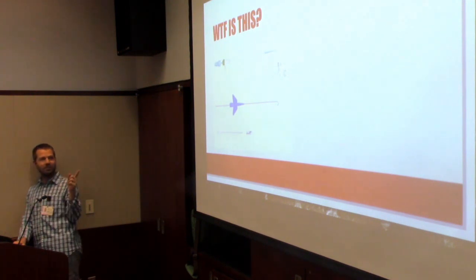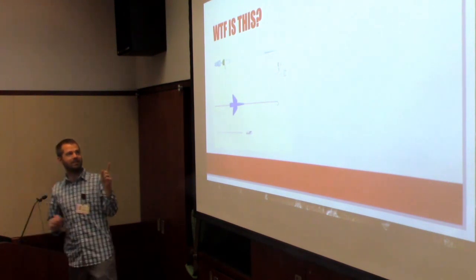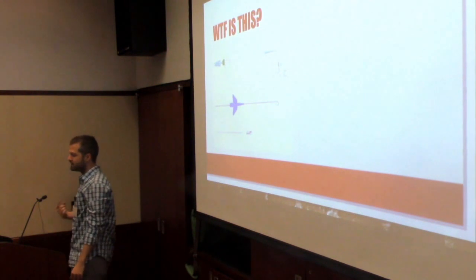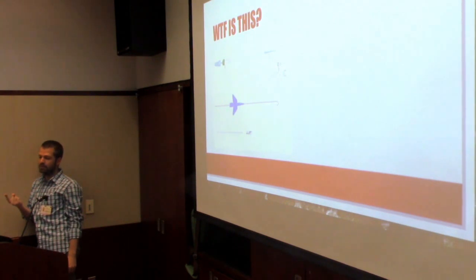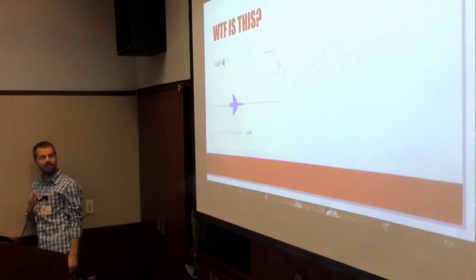So this is actually a European brand of what we all call a sheath introducer. It's basically just this section of tube that you're going to stick into somebody, and all these kits have essentially the same stuff in them. You've got a needle you're going to jam into somebody, a wire you're going to put through that tube, and then a dilator and a catheter. And there's 5 or 6 brands in the United States that make these things.